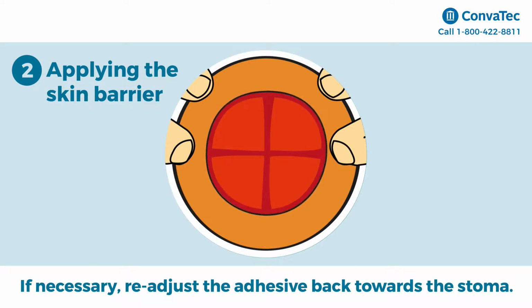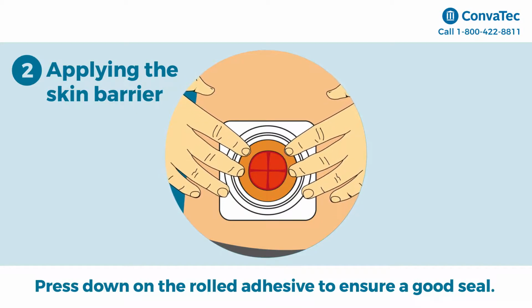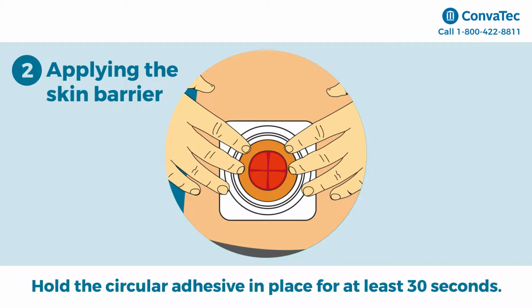Therefore, if necessary, readjust the rolled adhesive back towards the stoma to create a snug fit. For optimal performance, press down on the rolled adhesive where it meets the stoma to ensure a good seal. Do this along the entire perimeter of the stoma. Then, hold the circular adhesive in place for at least 30 seconds to secure the barrier to the skin.